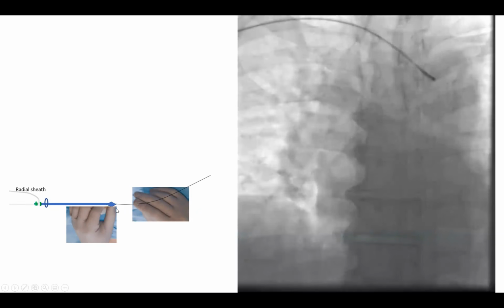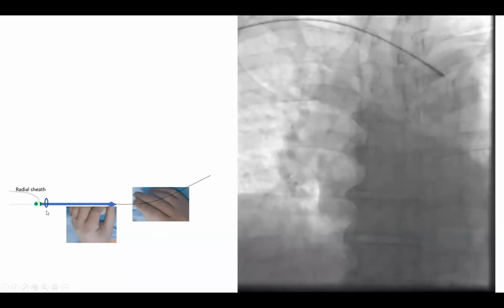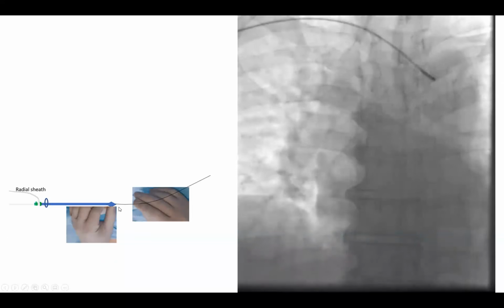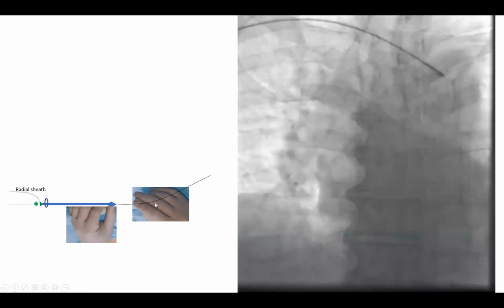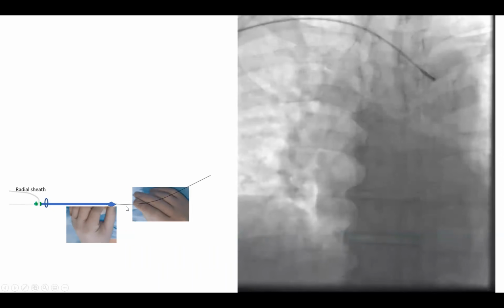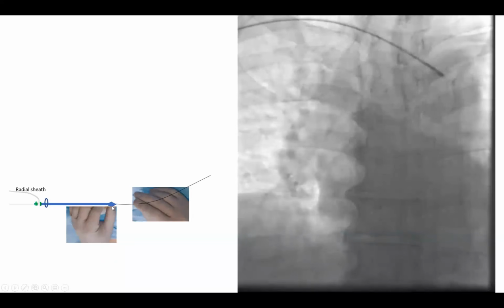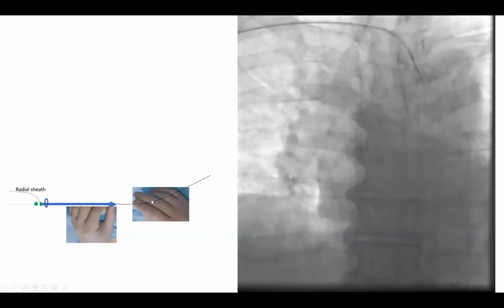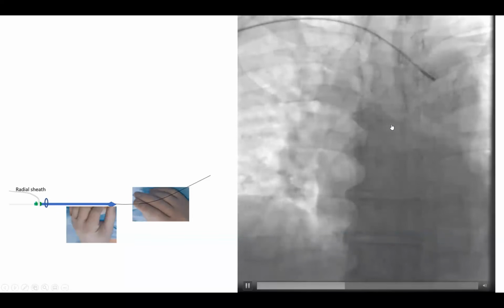jump. During that maneuver, unlike when we engage, where both my hands are on the catheter to clock and counterclock, for this, as is always the case when my wire manipulation is relevant, both my hands are on the back. So the left hand is here on the back of the catheter, pulling with a counterclock, while this hand has the wire, pulling the wire, then ready to re-advance it after the jump.